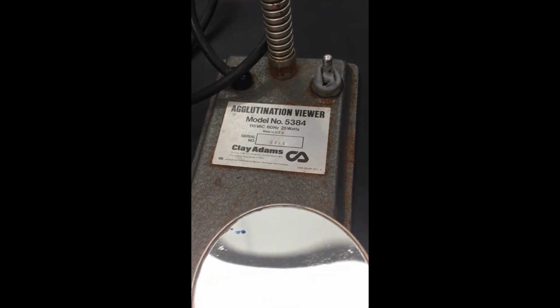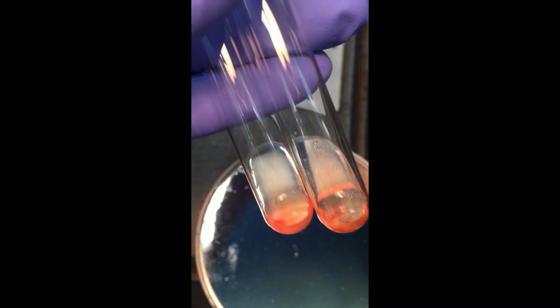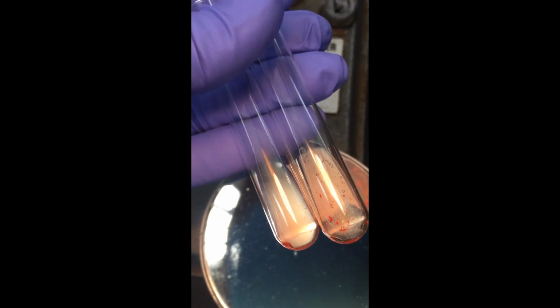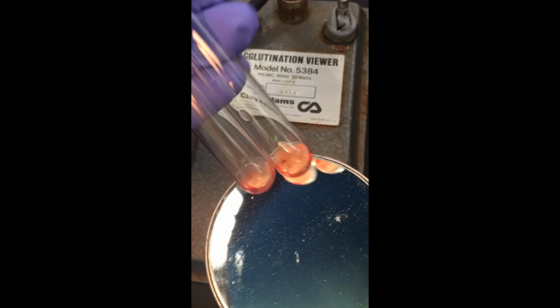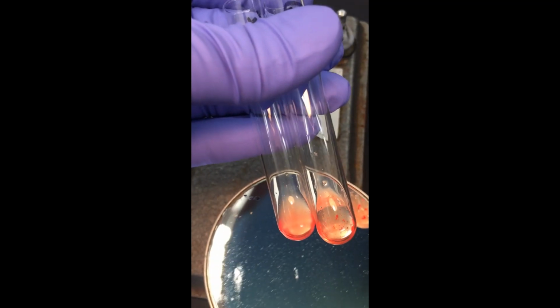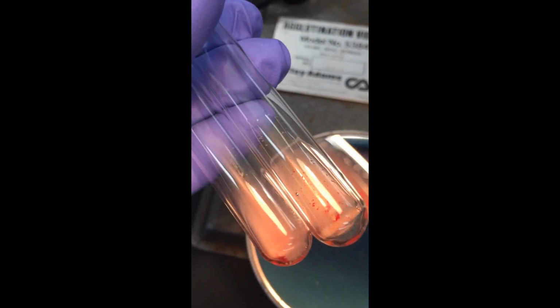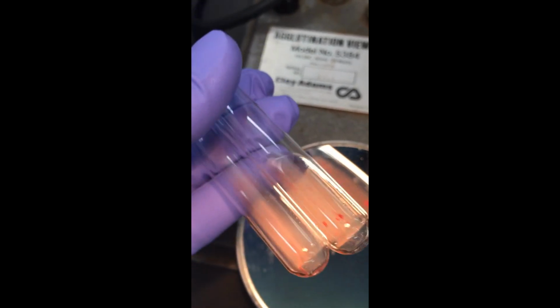All right. And last is tubes 5 and 6. Tube 5 is on the left, tube 6 is on the right. Let's see if I can get these anywhere close to, oh, that's better. You see the swirls in tube 5.